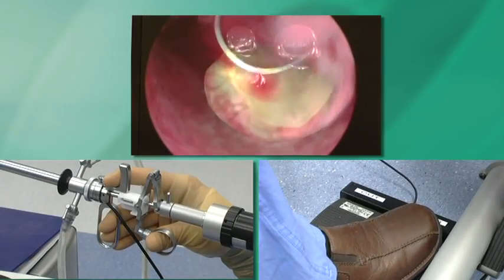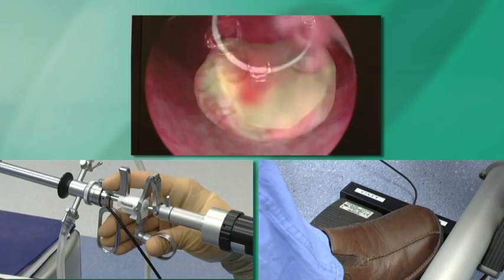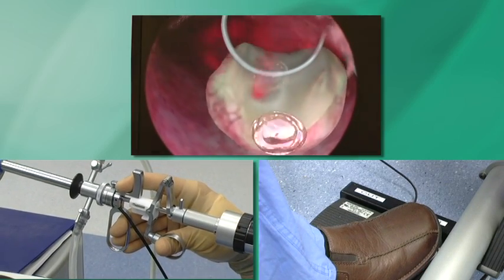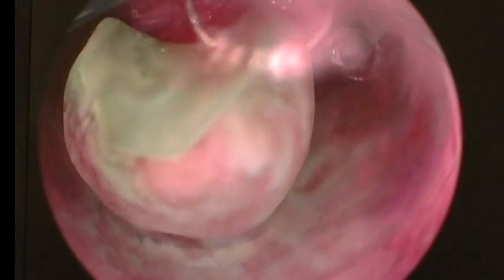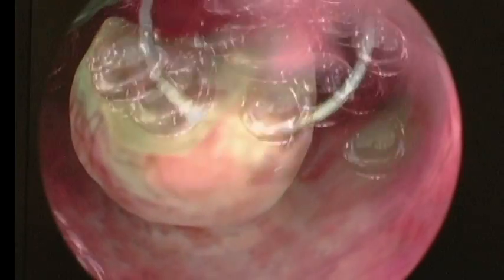It even gives you bleeding from a vascular fibroid, so you can use your coagulation on your loop to take care of the bleeding. You can continue to perform your resection just the way you would normally do on a real patient in a real OR.